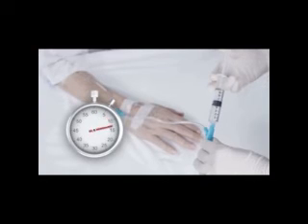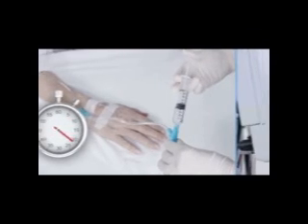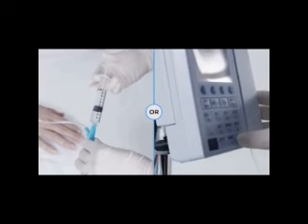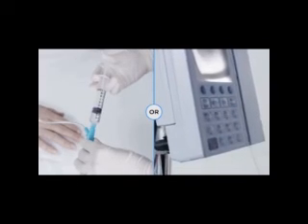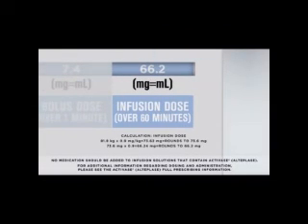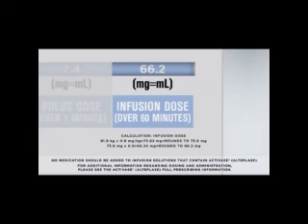Then administer the initial IV bolus over one minute. Administer the IV bolus directly through the Y-side injection port of the vented IV tubing, or program the infusion pump to deliver the bolus dose. Immediately following the bolus dose, infuse the remaining 90% of the 0.9 milligrams per kilogram dose over 60 minutes.